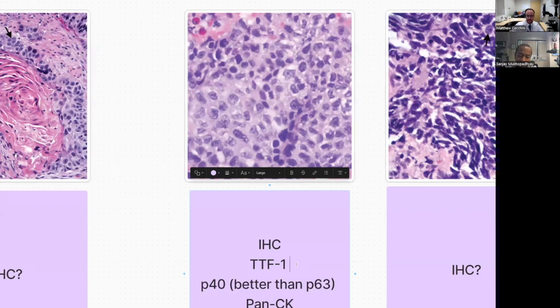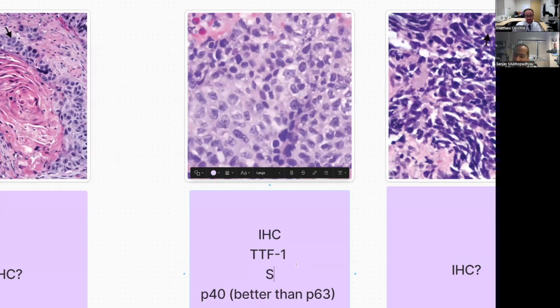Agreed. And then maybe we chat a little bit about clones of TTF1 in this case as well. Great topic. And about which one and why they're different and what we should think of there. So the main clones really, I think, are SPT24 and 8G7G3/1.